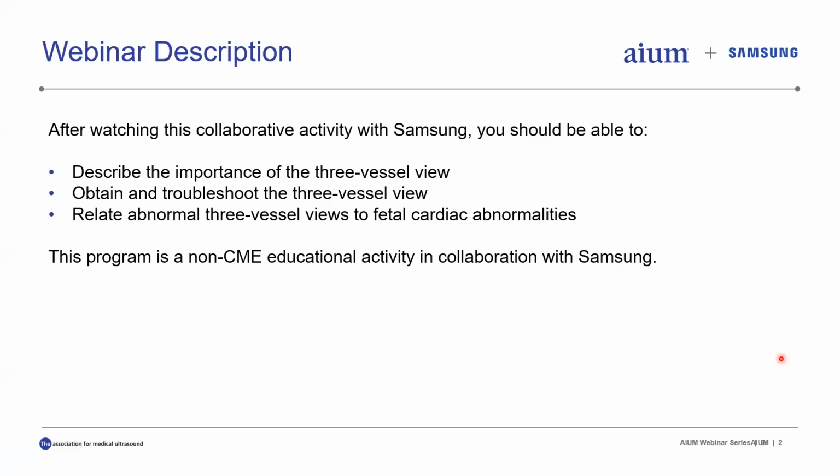This program is a non-CME educational activity that is put together in collaboration with Samsung. After this activity, you should be able to describe the importance of 3-vessel view, obtain and troubleshoot the 3-vessel view, and relate abnormal 3-vessel views to fetal cardiac abnormalities.